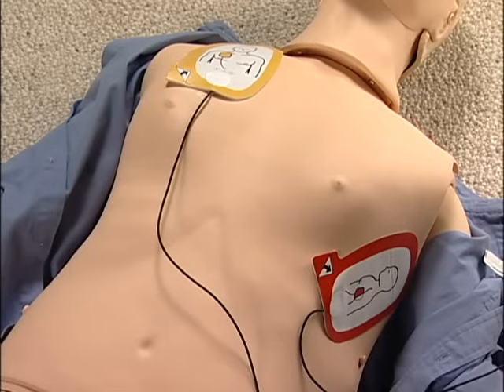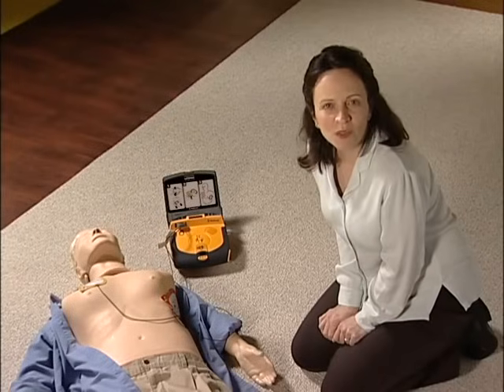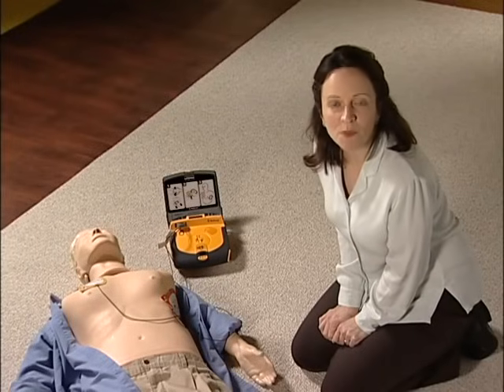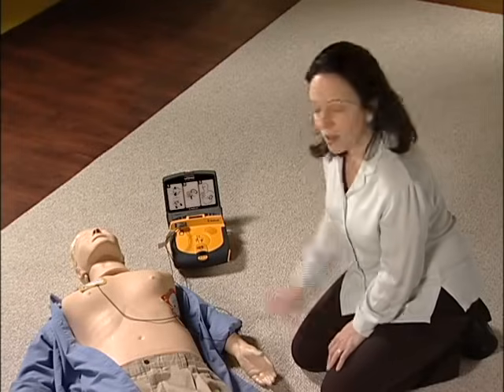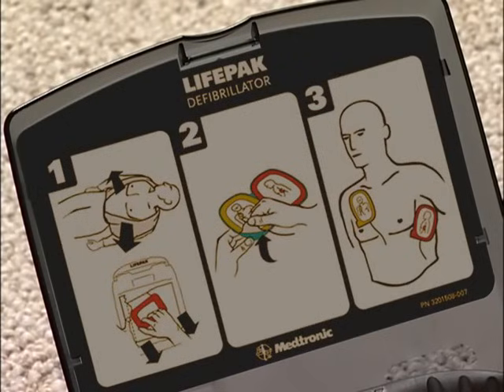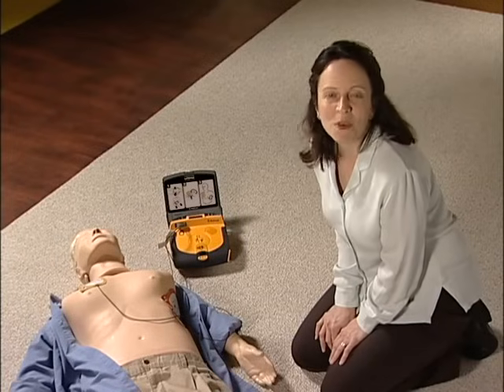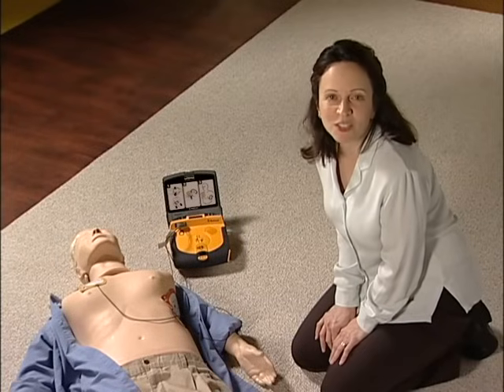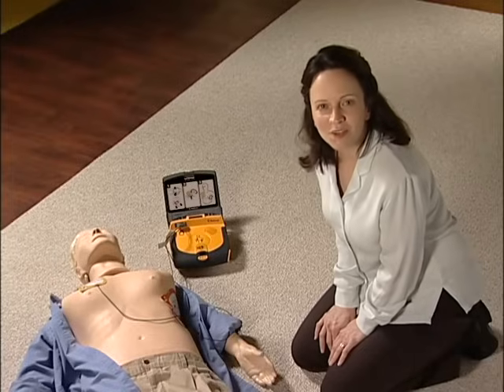The LifePak AED will keep monitoring the patient and will tell you if another shock is needed. And that's it. Just do what the LifePak AED tells you from the moment you turn it on. You can also refer to the quick reference guide inside the lid if needed during an emergency. When the emergency medical team arrives, you may have saved critical time by starting treatment before they get there. Even better, you might have just saved a life.